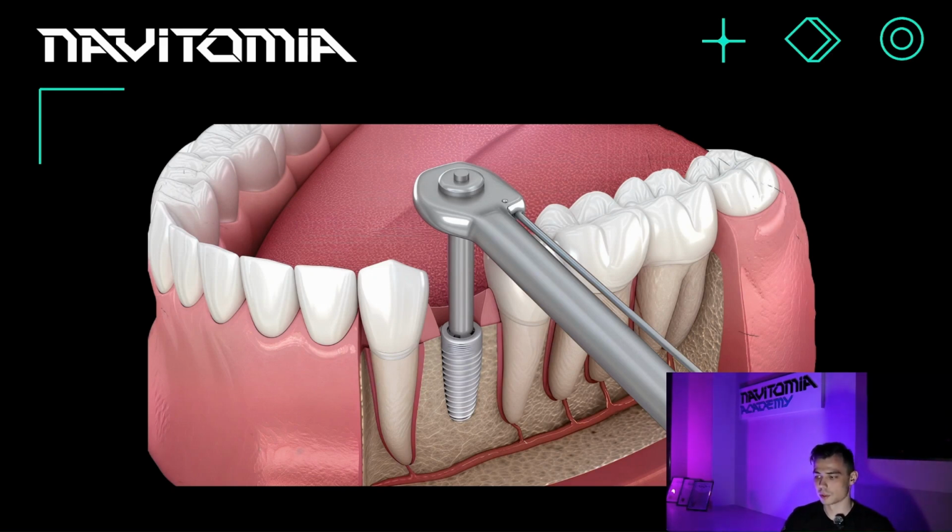So the strength with which the bone connects to, or rather resists the implant, is called torque. Accordingly, the surgeon uses a torque wrench if they are placing implants manually, and this torque wrench shows the amount of resistance the surgeon applies to the instrument in order to screw in the implant. Torque affects the primary stability of the implant and consequently influences the possibility of immediate or early loading of the implant in the future. But let's take it step by step. So why did I show this torque wrench here?